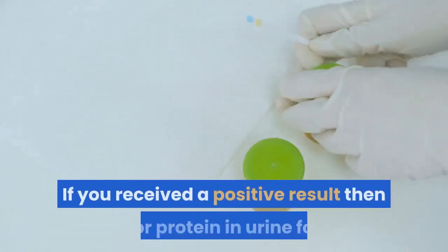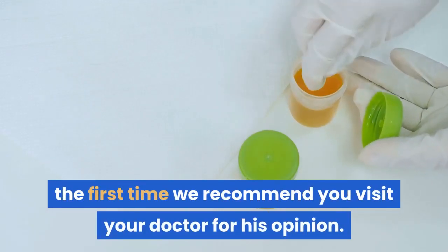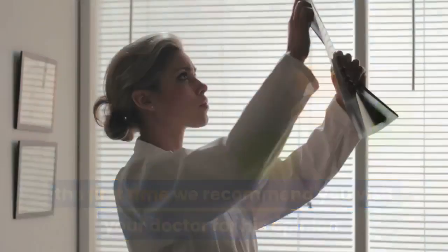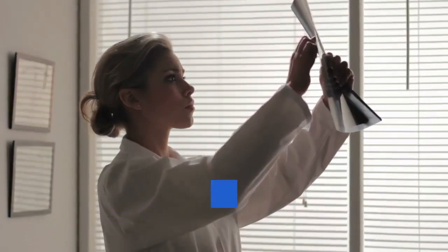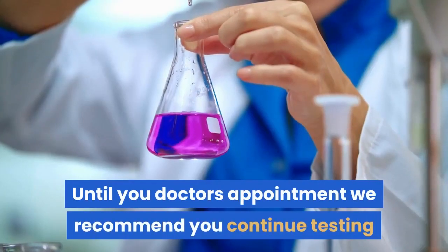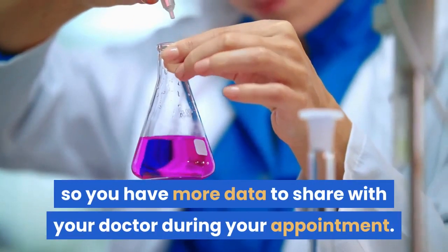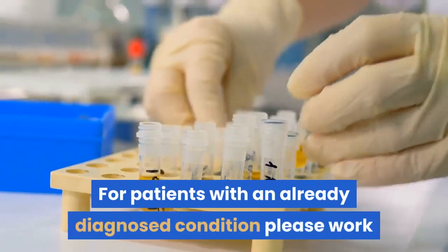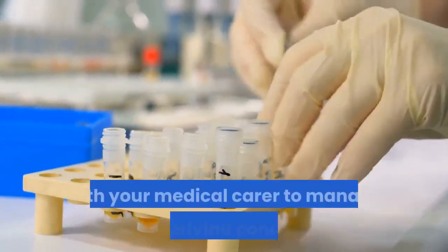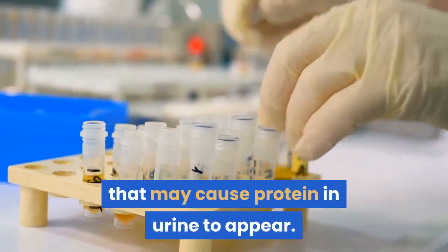If you received a positive result for protein in urine for the first time, we recommend you visit your doctor for their opinion. Your doctor can carry out laboratory tests to diagnose the underlying cause. Until your appointment, continue testing so you have more data to share. For patients with an already diagnosed condition, please work with your medical carer to manage the underlying conditions that may cause protein in urine to appear.